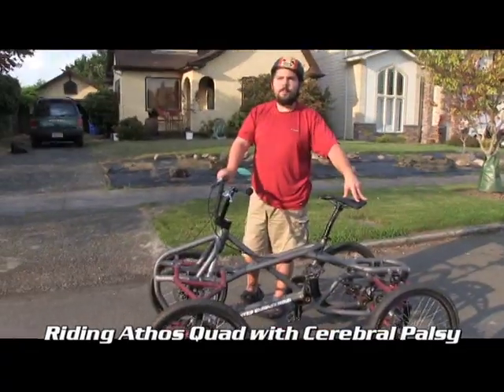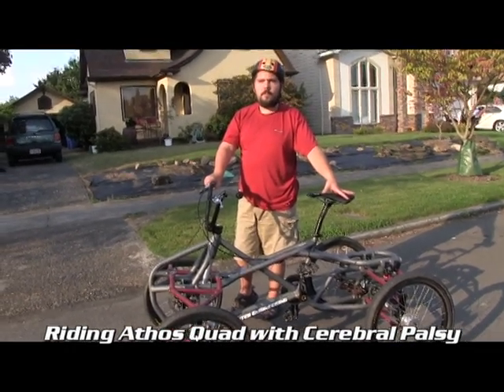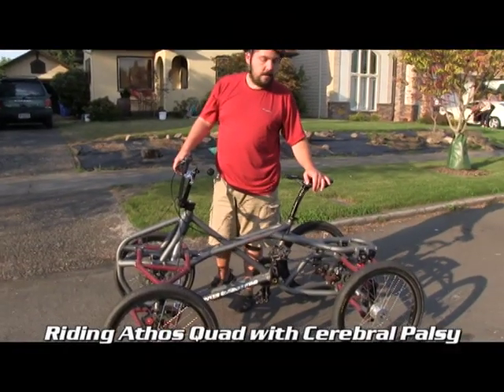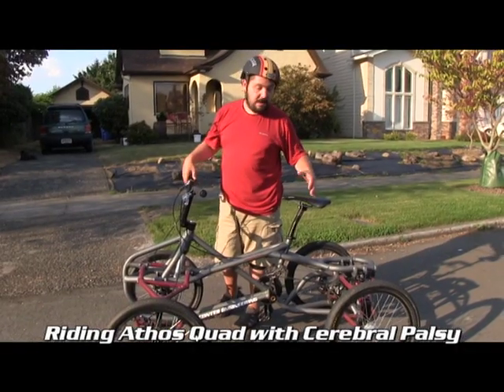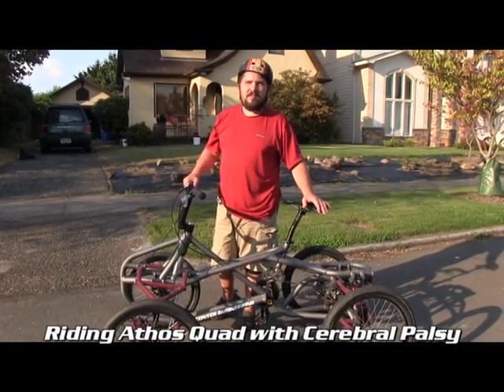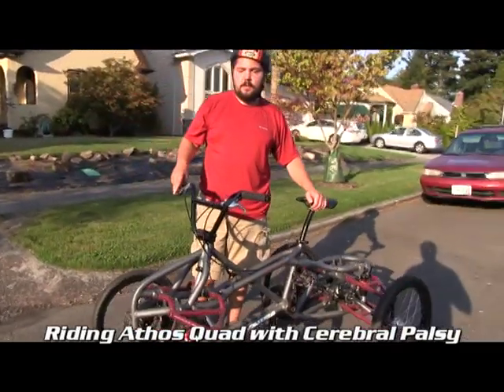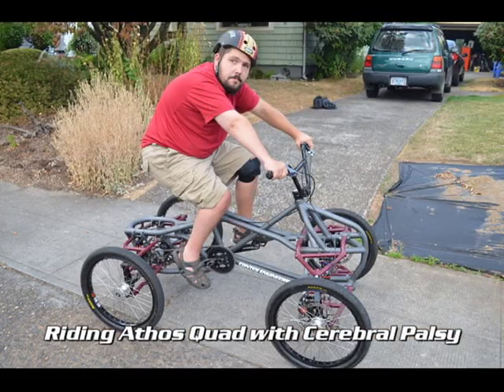I noticed when you were getting off the bike, you threw your leg over. It didn't seem too difficult. How does that compare with the recumbent bikes? I mean, because that's a lower stance, right? Is it better or worse? It's actually better on this design, because when I get up off the bike, I'm already kind of standing, and I'm using the bike as my stability, and because it has the four wheels, that keeps things pretty stable. And if I hold on to the brake, then it stays perfectly still and allows me to get off of the bike safely.